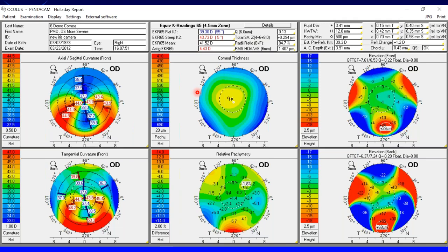Another case shows the classic 'crab-claw' pattern — a thin spot at the inferior peripheral cornea with dramatic elevation on both front and back surfaces. This is pellucid marginal degeneration, with thinning at the 6 o'clock position. The posterior elevation is especially important because the upper eyelid rubs across the anterior corneal surface and flattens the epithelium over the cone, masking anterior elevation. Posterior elevation, unaffected by lid rubbing, is always more pronounced and reliable for diagnosis.